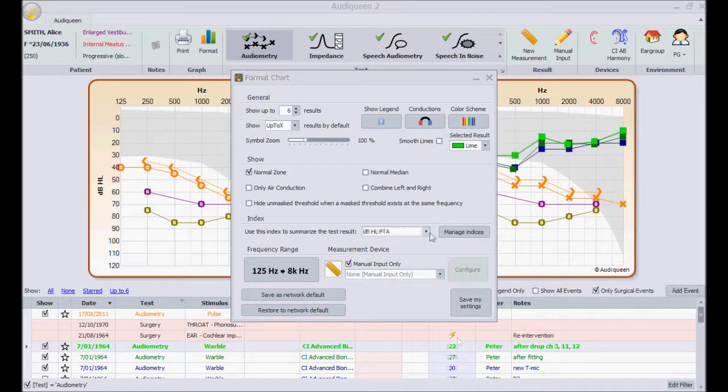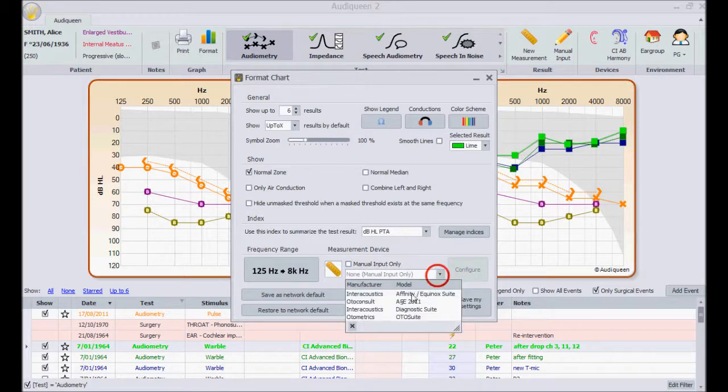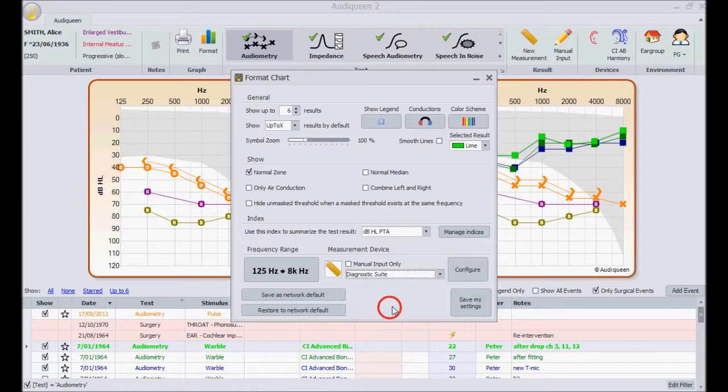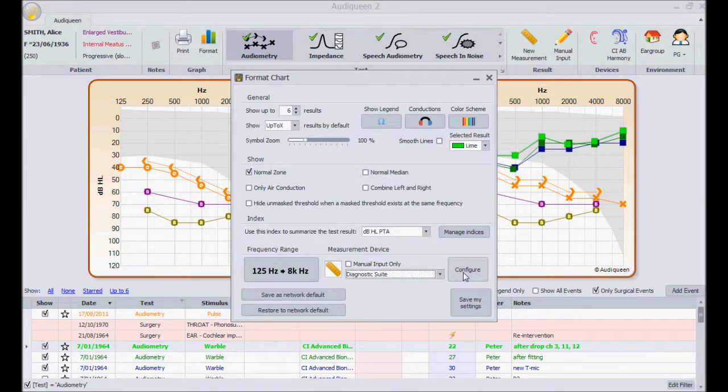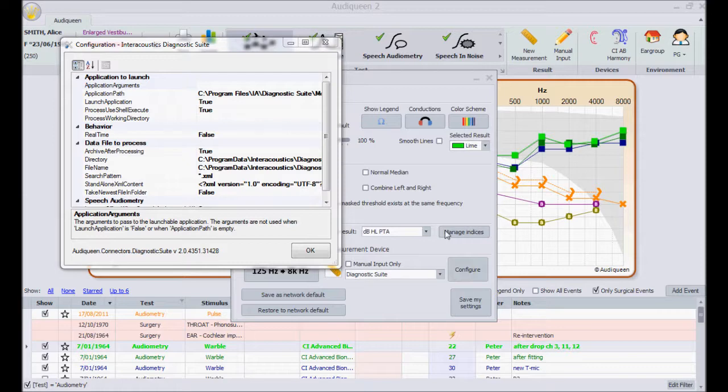Finally, if you have different connectors for different audiometers, here is the place to select one. The configure button should only be used by experienced administrators, and preferably in consultation with a distributor or with a to consult.